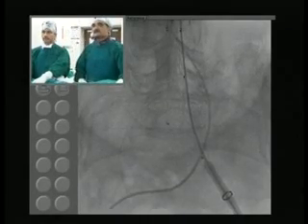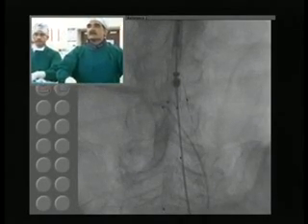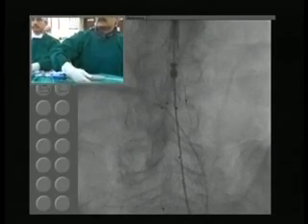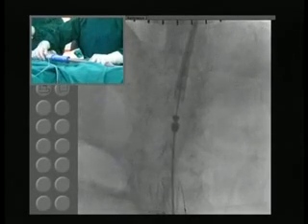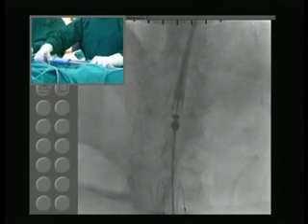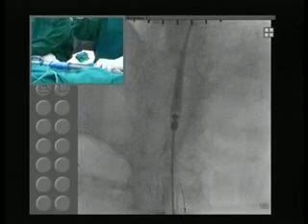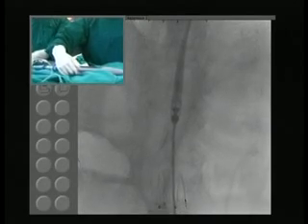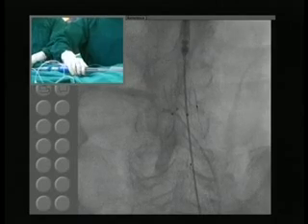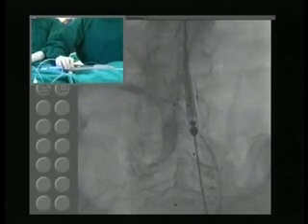Okay, go back to the top, please. Okay, so the next thing is to rotate the whole device and take it up, free it of this. And then, now I rotate the spring wheel back. Okay, so now that the top cap has come and affixed itself to that knob that is there. Show lower down, please. So now I'm going to bring the whole device down with a little bit of rotation. Yeah, now it's inside the device.